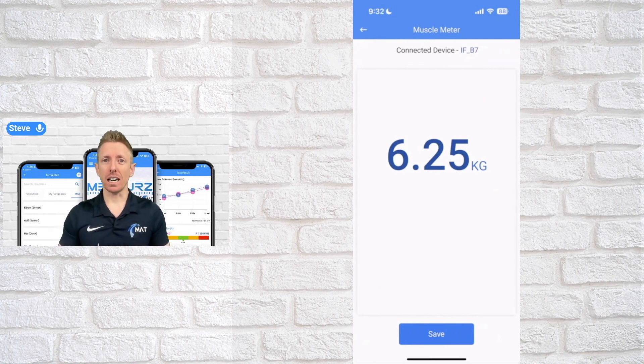The first time you set it up, you'll just go through those three steps — it'll literally take five seconds to get connected once you select the MAT device. Every subsequent time, as long as your device is on, it should automatically connect.